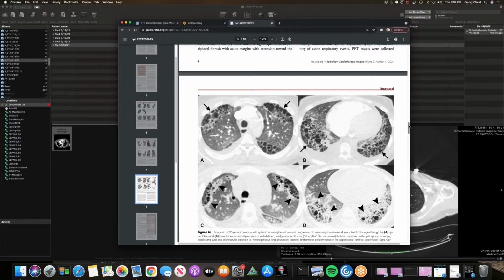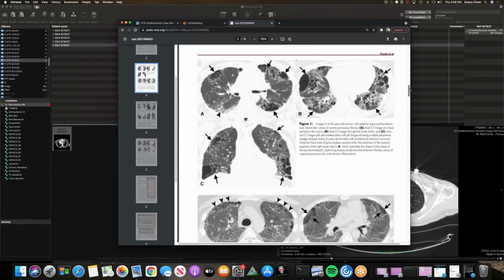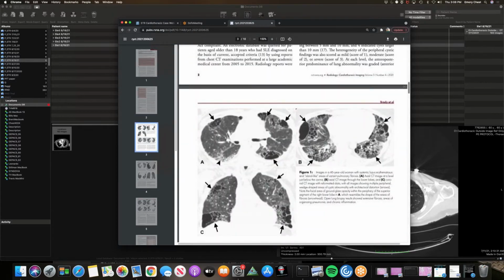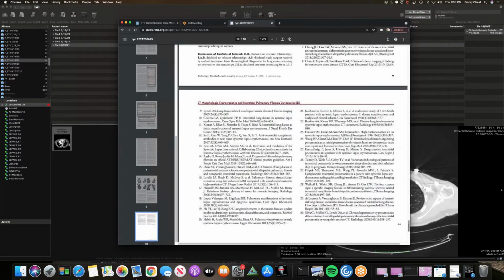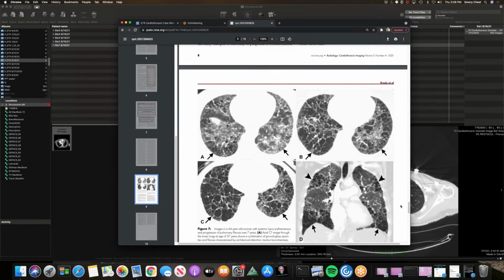Clearly there are these discrete macrocystic areas, but the only thing that would make me wonder why it looks a little different is the vascular component. But I don't know if in their references they had any papers that didn't have biopsies or autopsies. I admit I just read through the pictures and skimmed through it. I haven't had a chance to read it in detail, but I'm curious what your experience has been. I'm not sure if there's a vascular component. I think that hasn't been really clarified. As far as what's exactly causing this, I'm not sure at all.